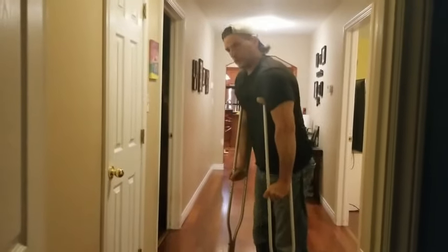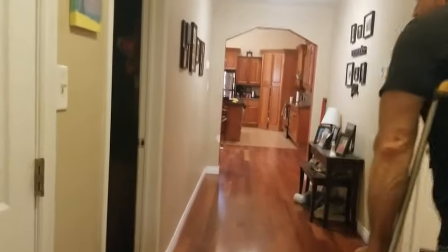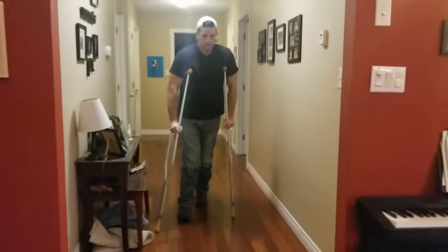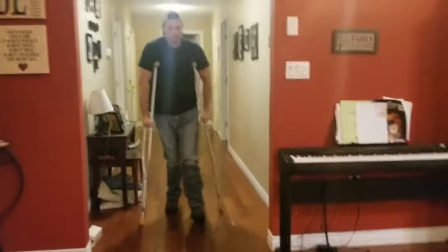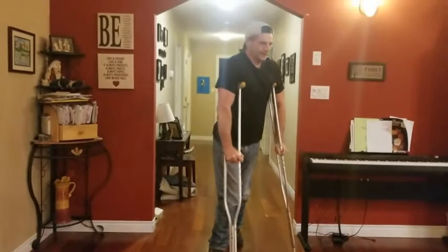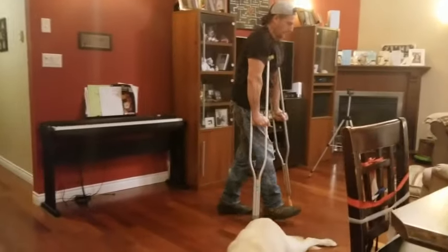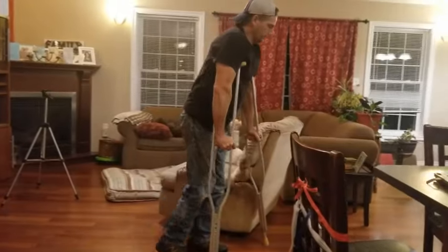I'm going to turn and then come back down. I'm going to go this way — a little obstacle. I could probably do this better with more practice and build up my endurance.